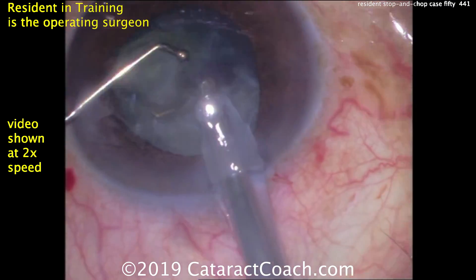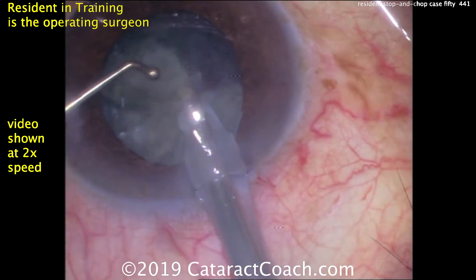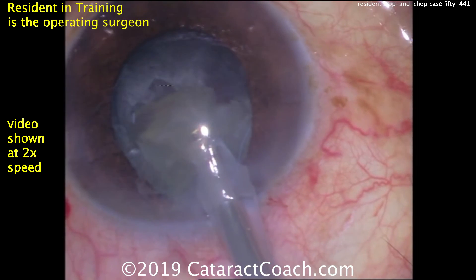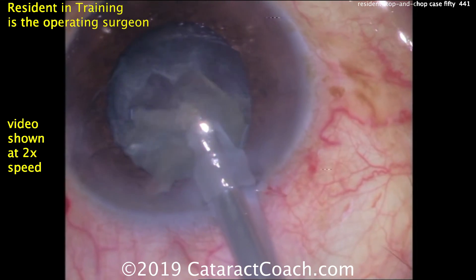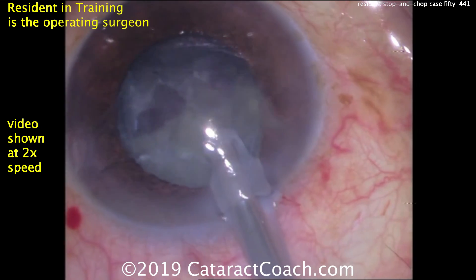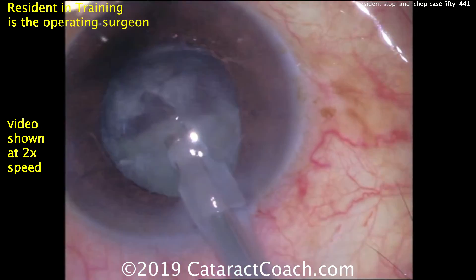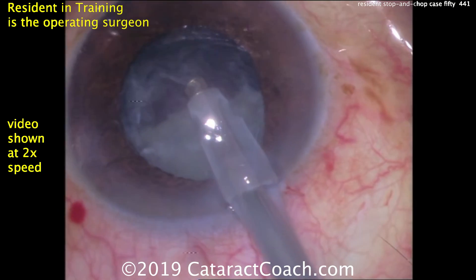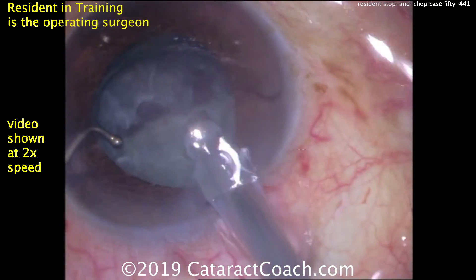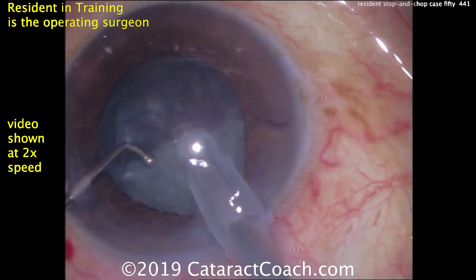Stop and chop was first described by Paul Koch from Rhode Island, USA. His idea was to make a central groove in the middle and split the two halves — much like divide and conquer — but then instead of doing four quadrants with grooves, you bring up each hemi-nucleus and phaco-emulsify it, using the chopper to break it up. The first half is gone with a nice rotation, using the chopper to bring the second hemi-nucleus in front of the phaco probe.